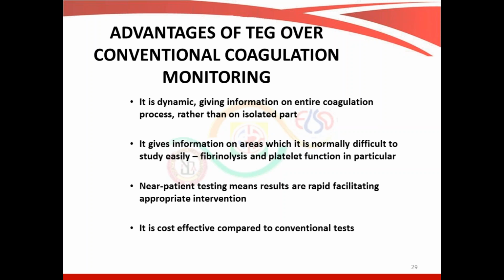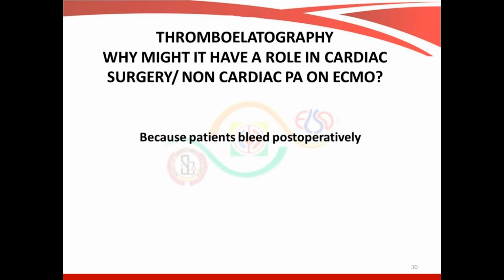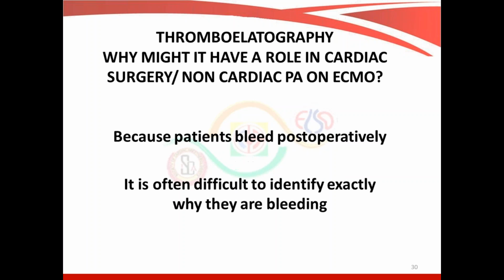I would say after doing 3 research projects on them, it is one of the most cost effective compared to the conventional tests of waiting for APTT. In our center, we are not doing APTT anymore unless these are redo surgeries coming and the patient continues to bleed, then we correlate. But we're using Sonoclot very, very judiciously. Thromboelastography may have a role in non-cardiac patients on ECMO because patients on ECMO are all the time bleeding.